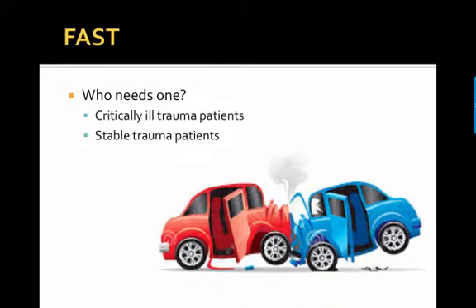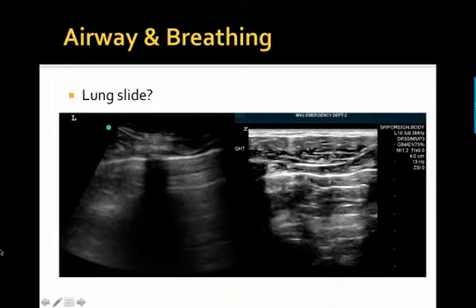I would also say that all stable trauma patients need a FAST. This way you can detect any early life-threatening injuries, and sometimes a FAST exam may be the only imaging besides maybe a chest x-ray that would be required in this trauma patient if they were stable.